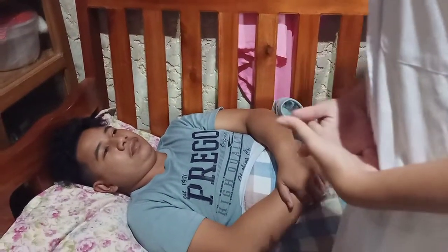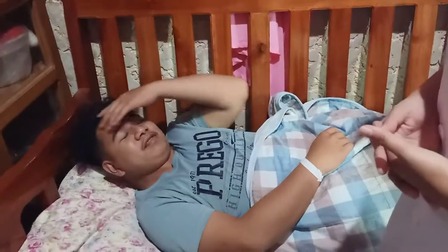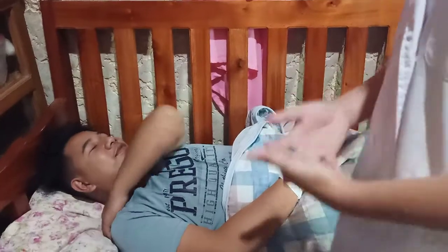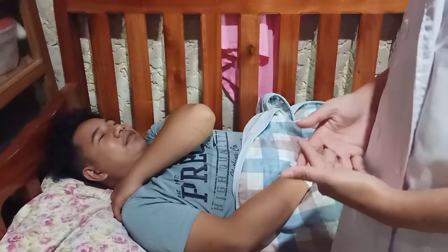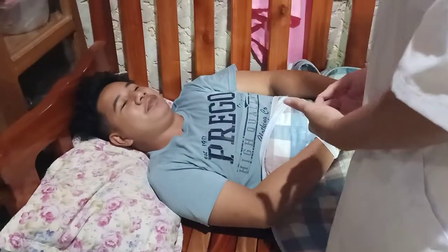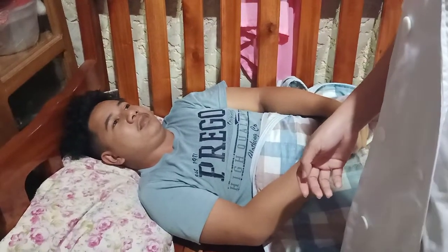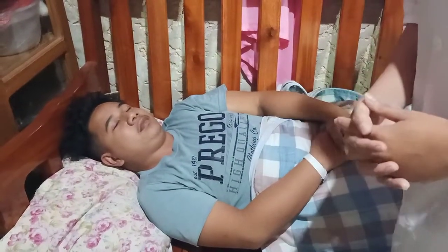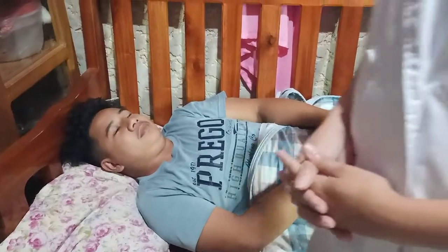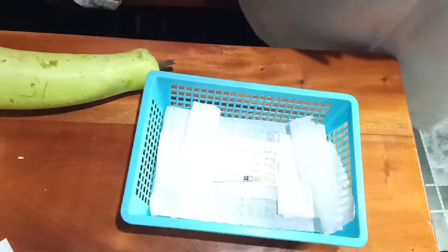So, today, sir, I will inject a small amount of penicillin into your skin to check if you are allergic or not to the penicillin medication. Is it okay with you? Yes, ma'am. Okay. And arrange the medication and drug in the hypodermic tray with the corresponding drug.